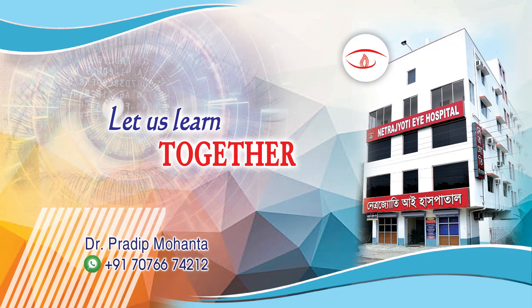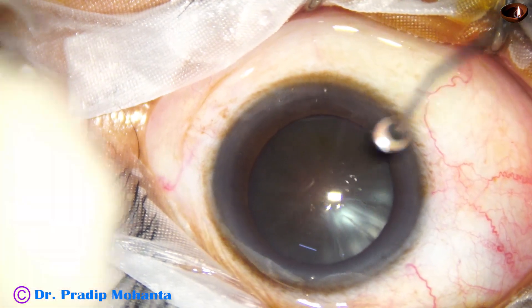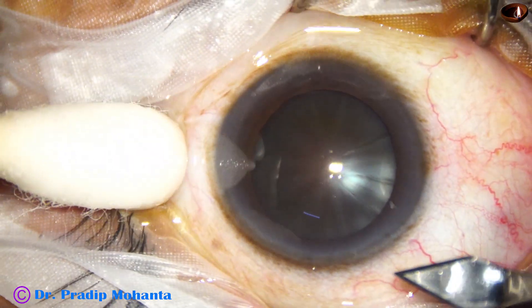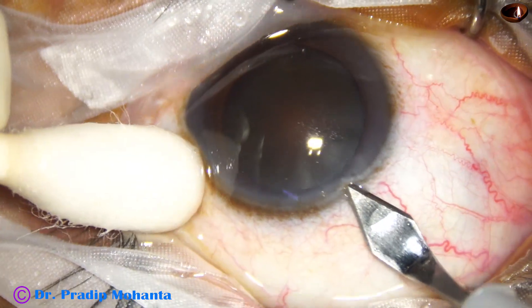Welcome to my workplace at Ranaghart, West Bengal, India. Let us observe phaco emulsification of this cataracta nigra. We can see this is a rock-hard black cataract, nuclear sclerosis grade 6, and I am going to do the submarine job technique in this case.